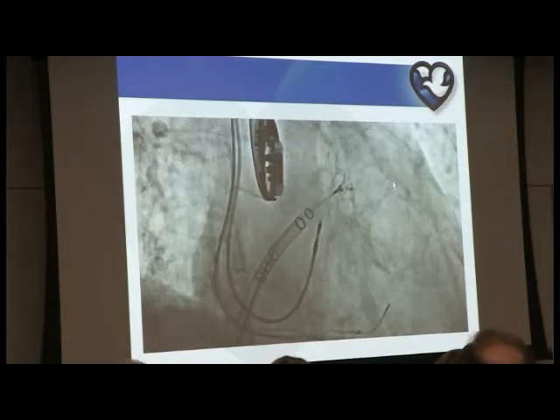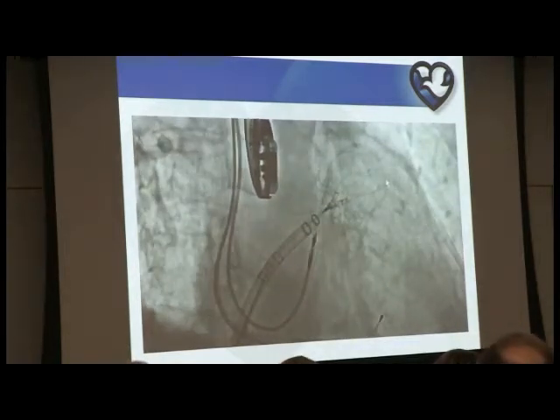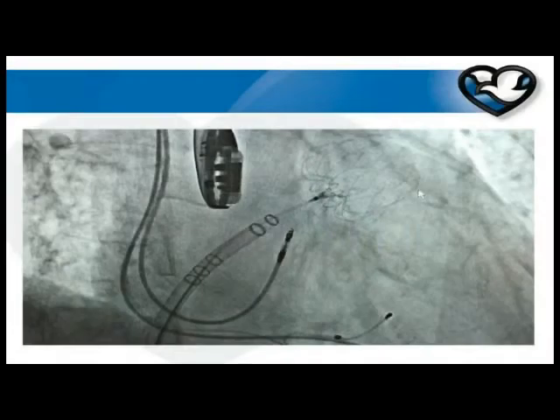And this is actually one from our lab. You can see this patient also incidentally has a biventricular pacemaker as well. But that's the device. It's still tethered to the actual delivery system. We have not released it. We're going through all the different pass criteria. And then if everything looks good, you just rotate the little knob counterclockwise, and that unscrews it right there. And the device is free.